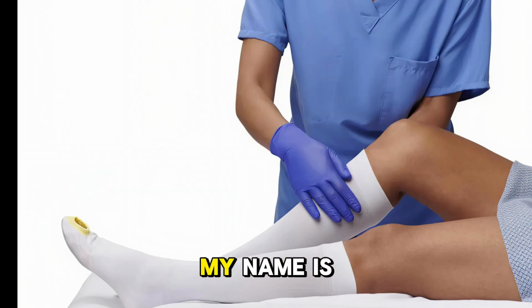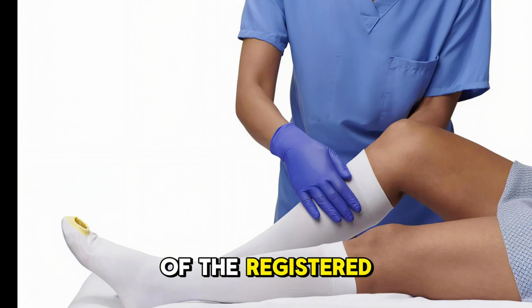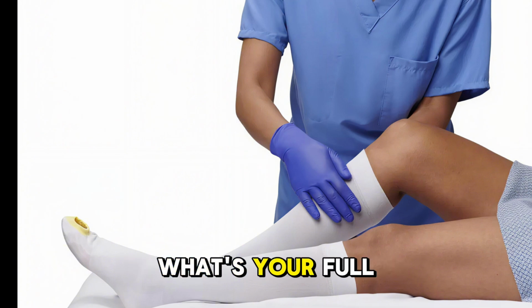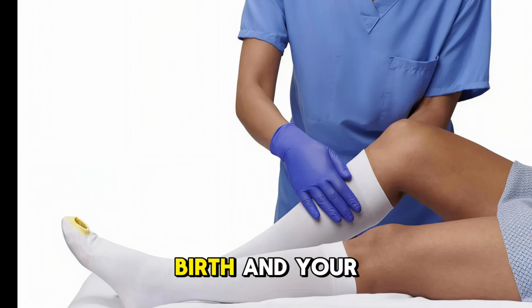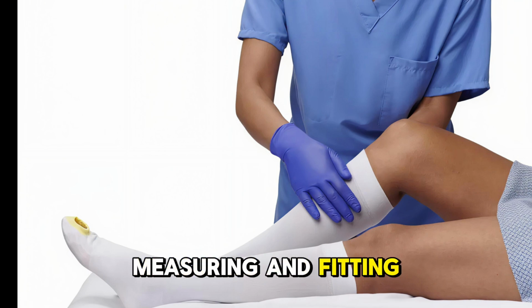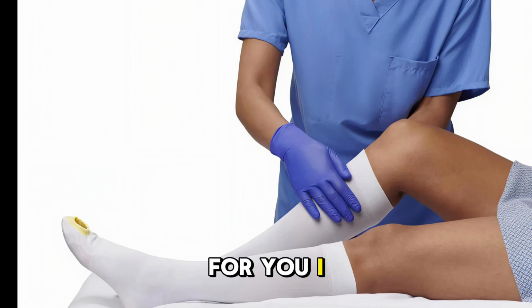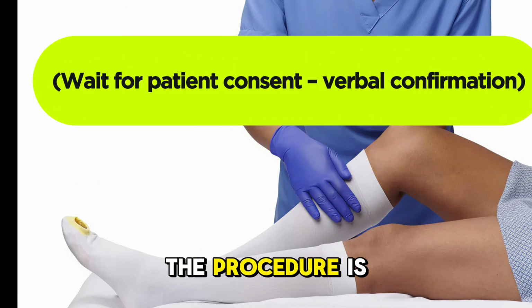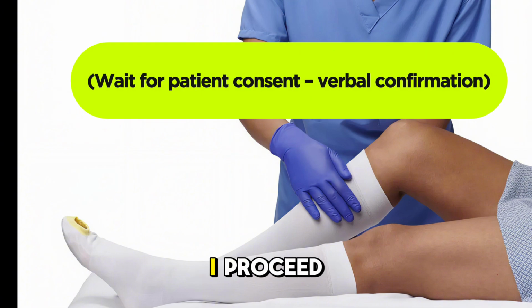Hello, good morning. My name is Sarah. I'm one of the registered nurses here. Would it be alright, can I check your wristband? What's your full name, please? And date of birth? And your address. Your hospital number is 123456. Today I will be measuring and fitting compression stocking for you. I will explain each step and ensure you are comfortable throughout the procedure. Is it alright if I proceed?